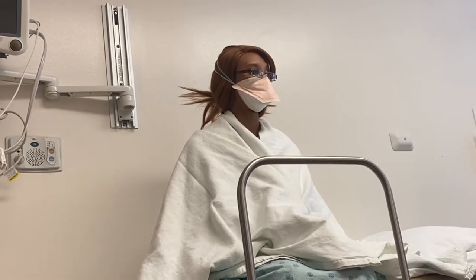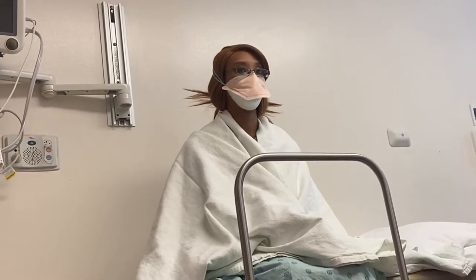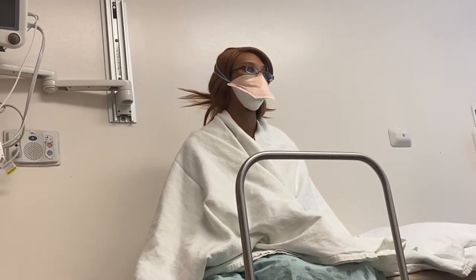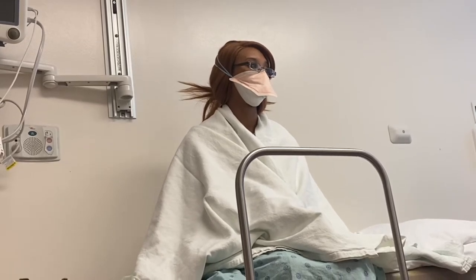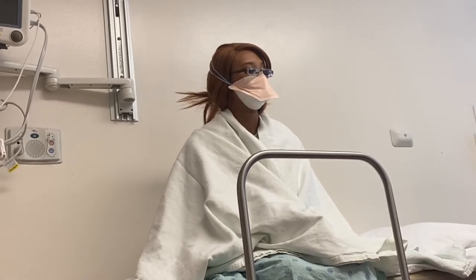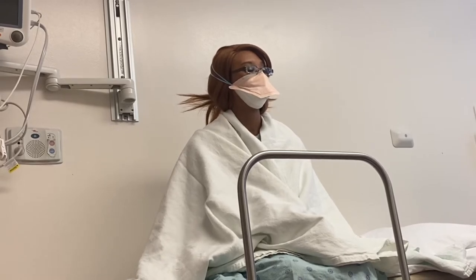Like I said, it's uncomfortable, but I'm gonna get you through it. We take our time, and we'll get you through it. Okay. How long does it take? Yeah. You schedule 2 hours, but it'll be about an hour and a half. And then you go home, and you'll have 2 phone numbers. You can reach someone 24 hours a day if you have questions. And things you might call about are recorder issues or needing clarification on the diary that you go home with. May I answer any questions?